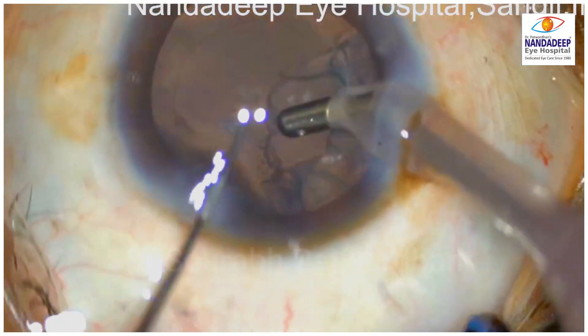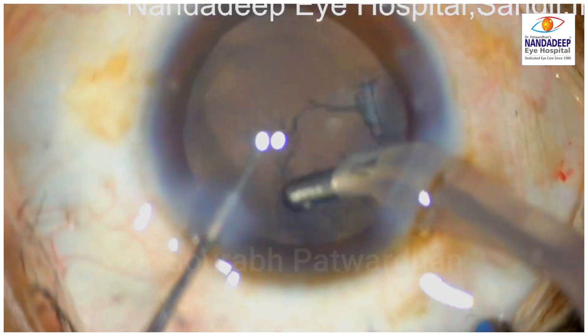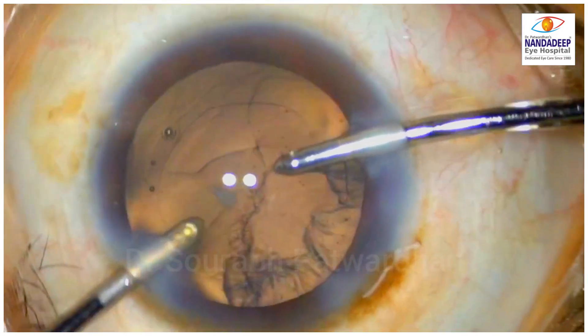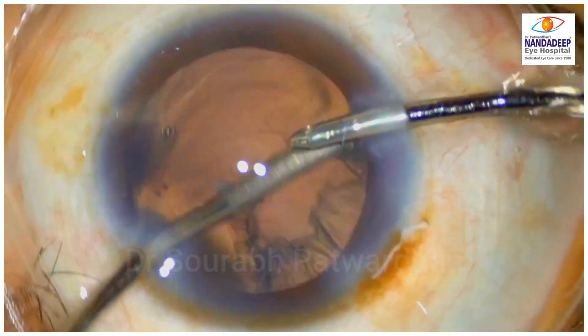Now the surgeon tried to take out this remaining cortex using the coaxial and noted that this cortex is trapped and the capsular tension ring is not allowing it to release. So the surgeon decided to shift to bimanual for a better approach.